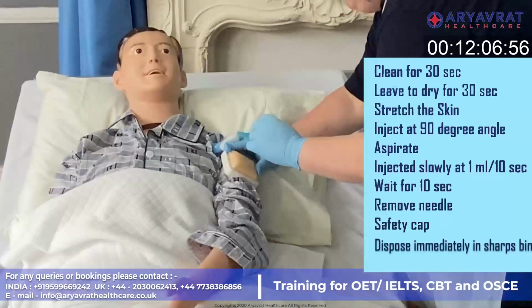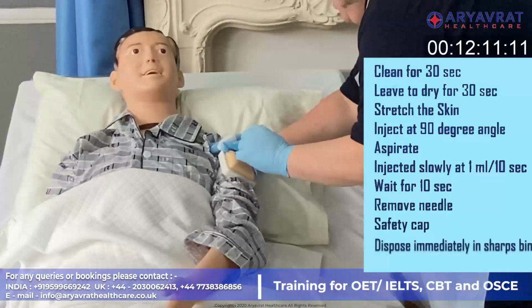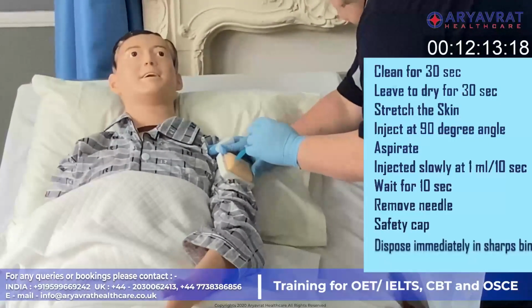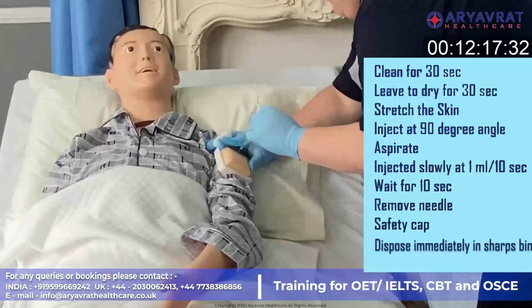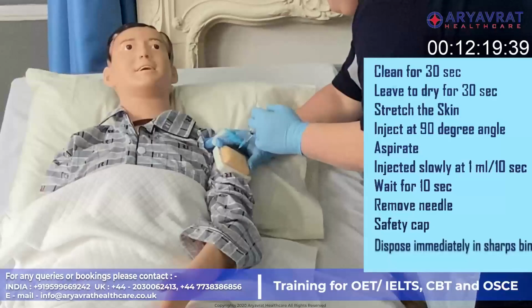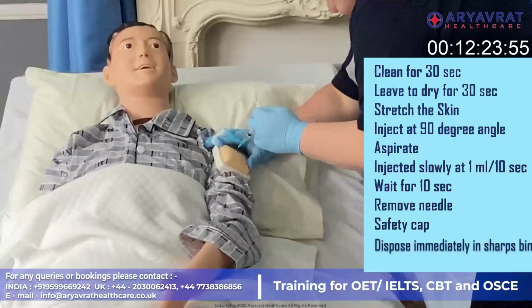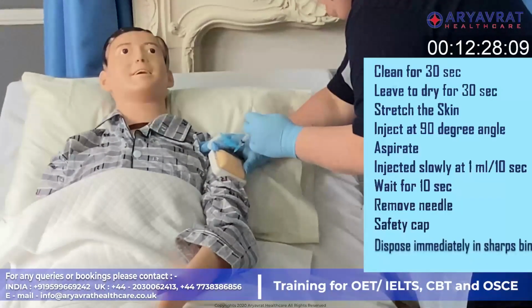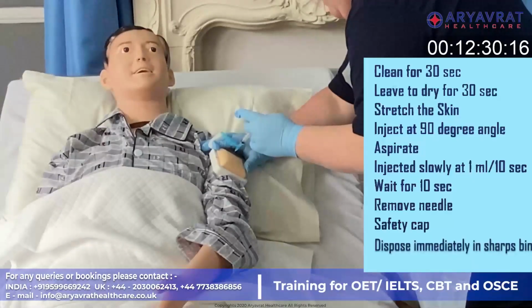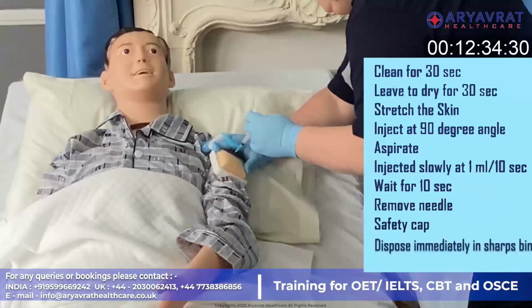Okay, I'm going to sharp scratch, coming in, and here we are. I'm going to inject it at a 90 degrees angle, making sure that there's approximately 1 centimetre left. I'm going to aspirate, and I'm going to inject slowly, counting to 10. So 1, 2, 3, 4, 5, 6, 7, 8, 9, 10. And I'm going to leave it there for another 10 seconds, Fred.